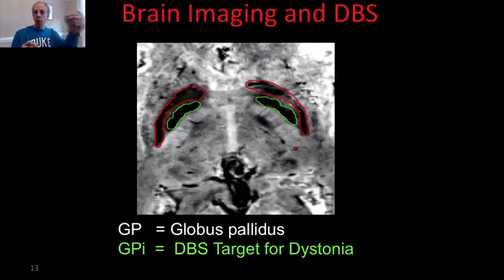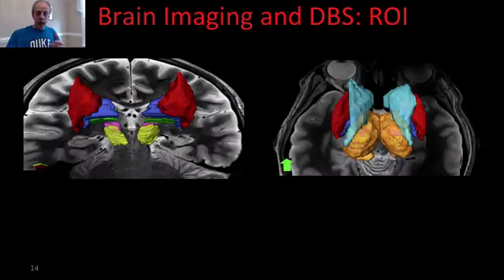I have multiple modalities: the T1, the T2, the SWI, the susceptibility weighted imaging, and then I compute vector gradients and I do these vector active contours to segment the regions. You get segments like this. Here are different regions of interest.